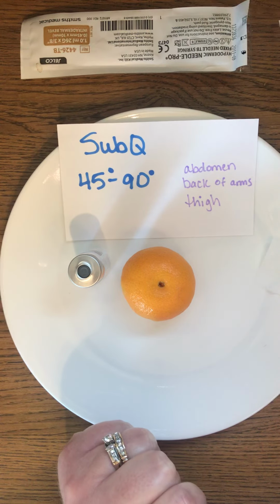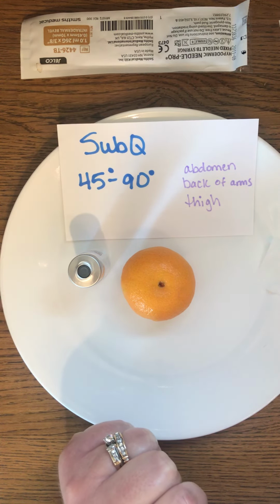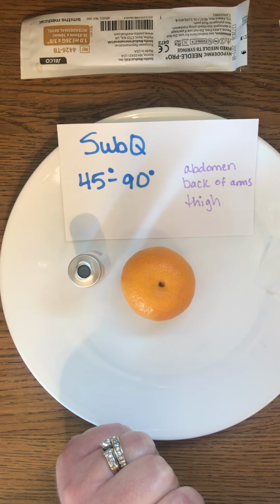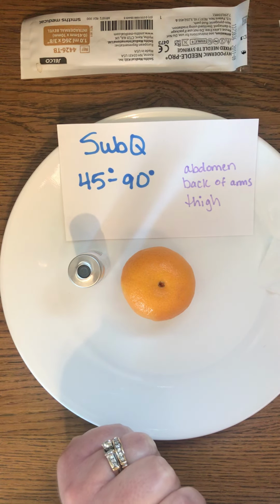So we typically end up using the little bit longer needle. That 5/8 inch needle may be used if we're going in at a 45-degree angle. If we're going to be going in at a 90-degree angle, typically that 3/8 inch needle is going to be sufficient. We want to pinch the skin for patients who are thinner.